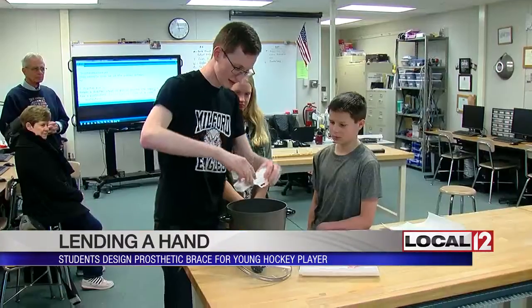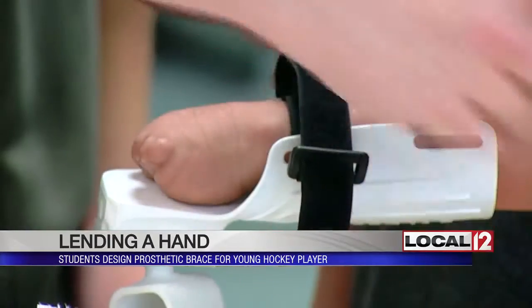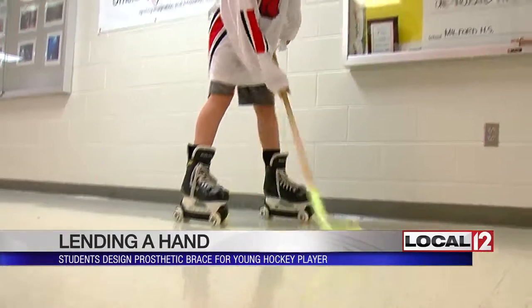The other prototype would have snapped too easily. So the students designed a ball and socket mount that allows Gabe to better move the stick. They acknowledged uncertainty about whether it will break if he falls or goes into a collision — which is likely, since it's hockey.